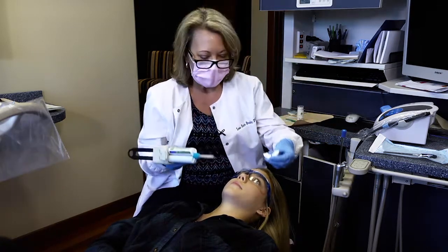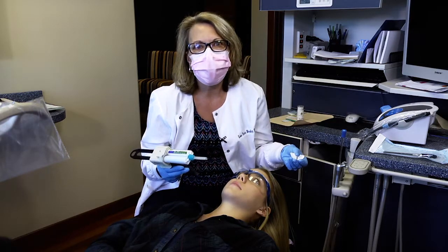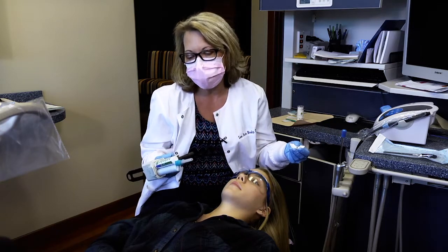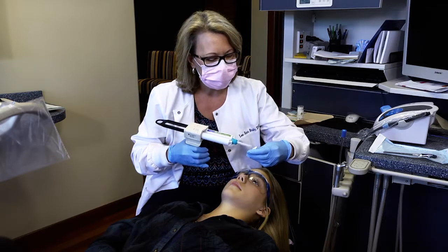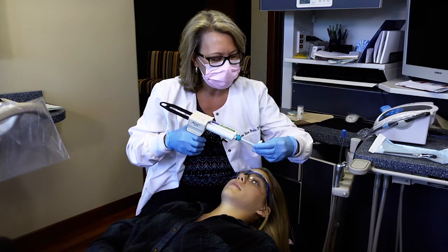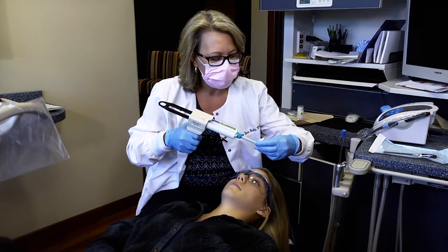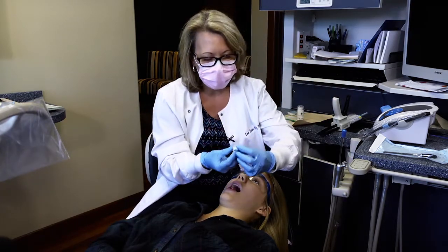All right. So your QuickSplints, you can reline with bite registration material or other types of silicone putty. Today we're actually just going to use the bite registration material. So what I'm going to do is fill the QuickSplint shell with the bite registration material. I do want to fill it. I like this material to go kind of right up to the top of the white part of the QuickSplint, but I don't want to overfill it.